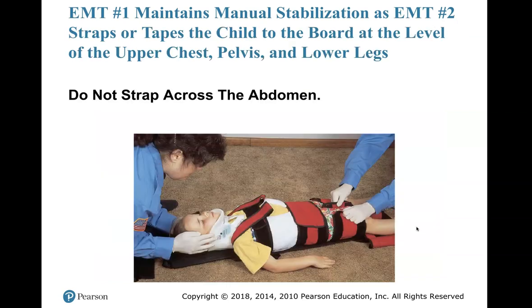And this is kind of funny. See if you get it. EMT-1 maintains stabilization as EMT-2 straps or tapes the child onto the board at the level of the upper chest, pelvis, and lower legs. Do not strap across the abdomen. I don't know what that is, but maybe that's not the whole abdomen. I guess they're calling that the pelvis, but it looks like part of the stomach to me. But okay.